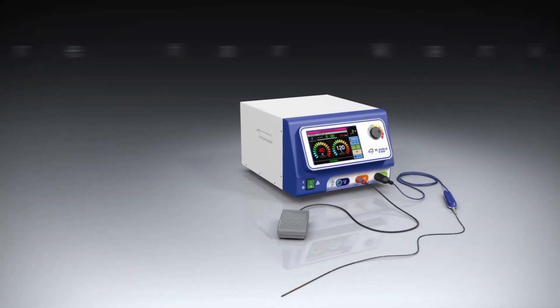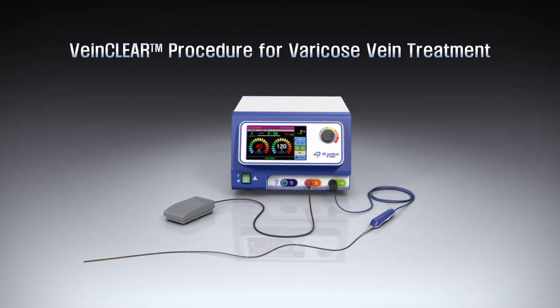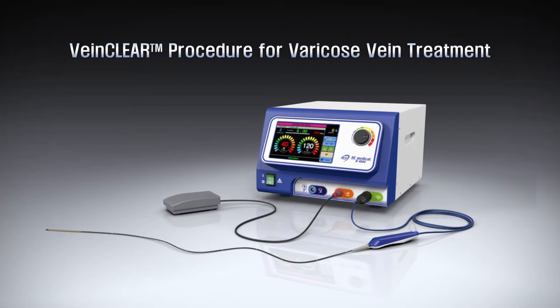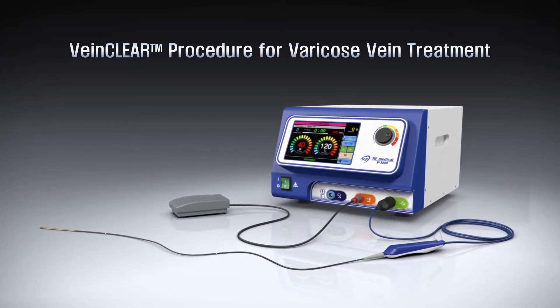The VeinClear procedure is a new varicose vein treatment procedure from RF Medical. It is an endovenous radiofrequency ablation therapy for varicose veins, usually caused by chronic venous insufficiency.